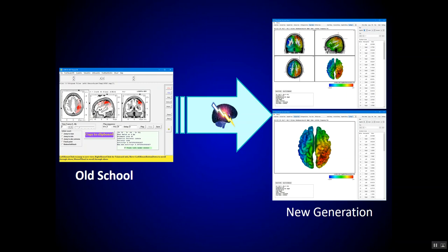However, it is no longer supported by the KEY Institute in Switzerland. It does not work with a lot of the graphics cards and various hardware that has developed since then, and it is not supported. So although useful, it's on its last legs. And one of the motivations that we had to develop the new generation NeuroNavigator Reviewer was in recognition of this excellent work that Roberto Pascual-Marqui had done and to try to provide something that is even better.